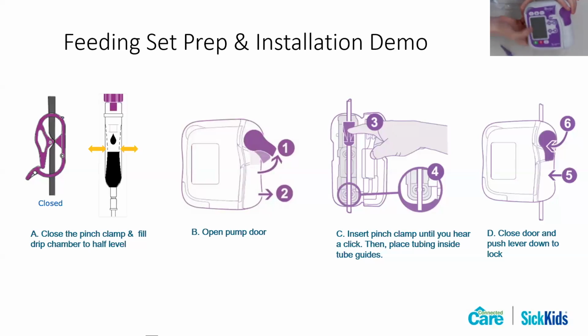Okay, so after some time, if you don't press anything, the screen will dim. Then that way, if I just press one of the buttons, it'll show up.